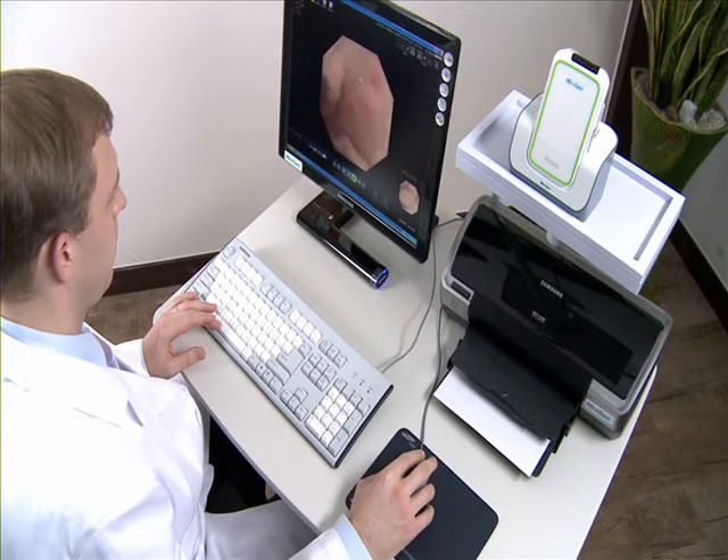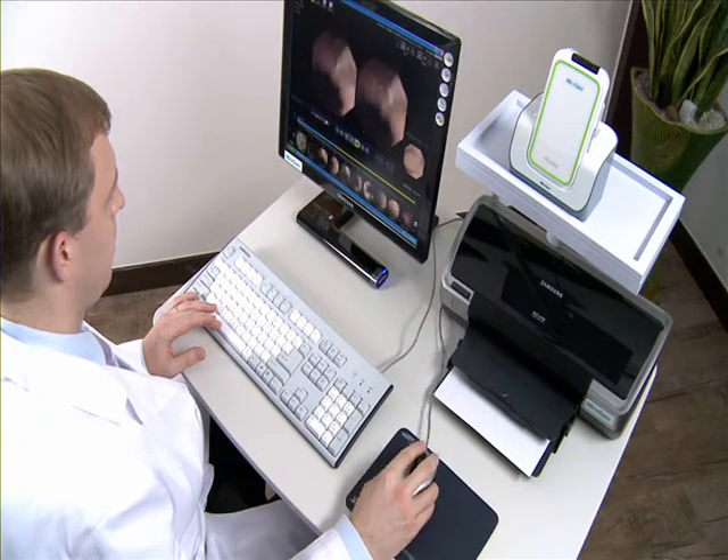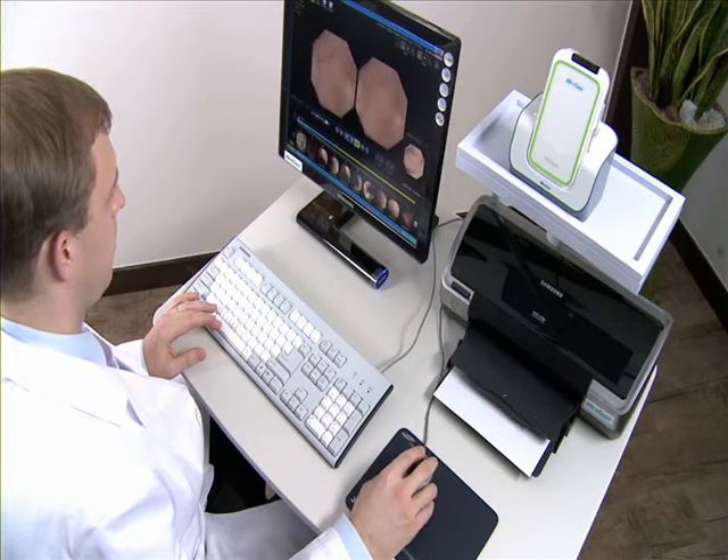The MyroCam capsule endoscope is a fast and accurate way to observe diseases of the small bowel.